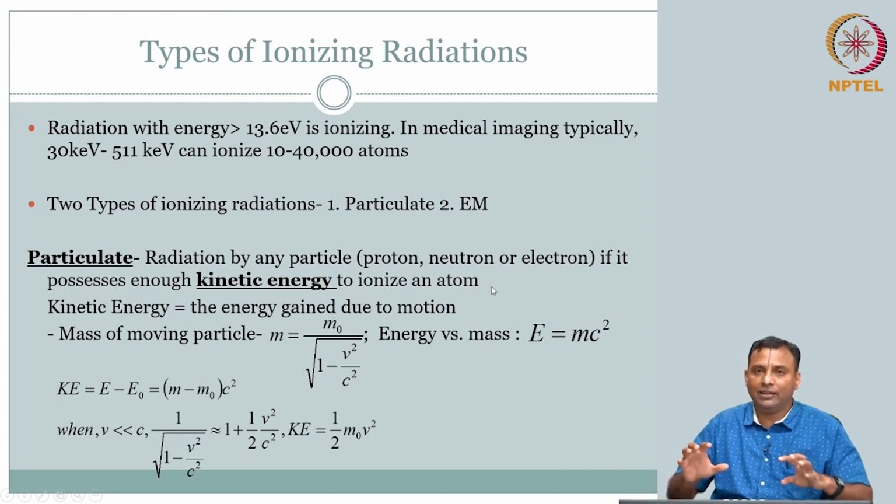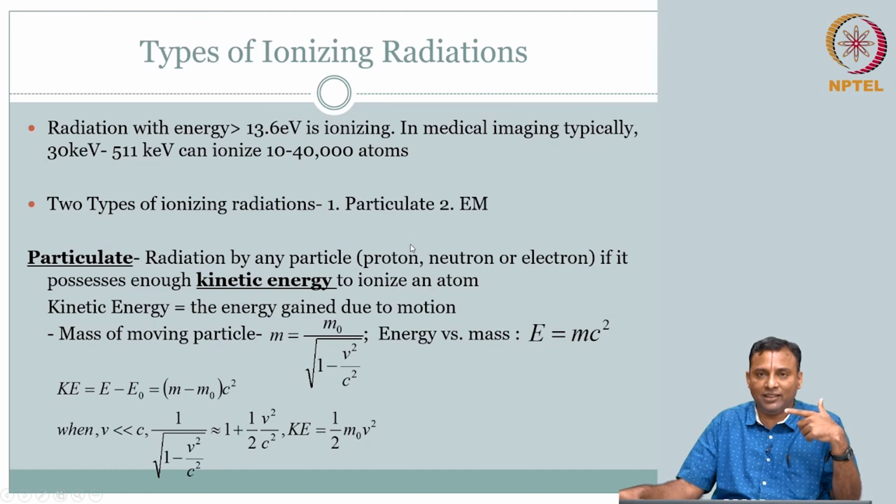If we cover that, that is a huge step. Remember the underlying principle: in X-ray projection radiography or X-ray CT, we are interested in capturing the attenuation property of the tissue to the X-ray energy. So if we cover what we mean by ionizing radiation and how it interacts, we get our clues as to what our potential signal is, right.